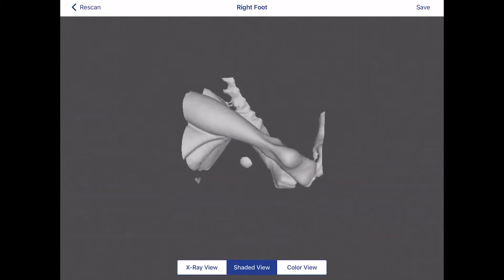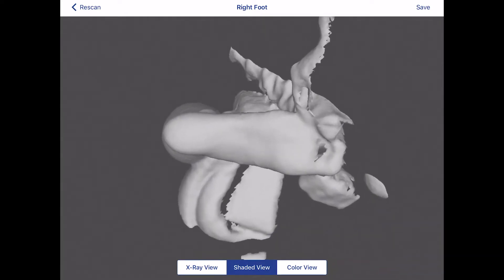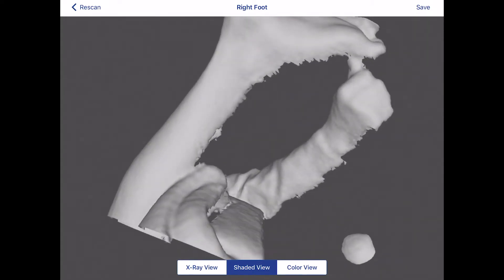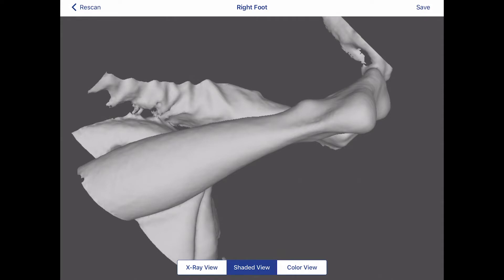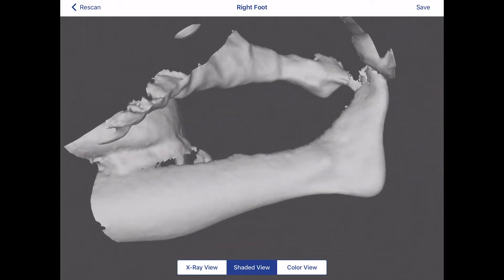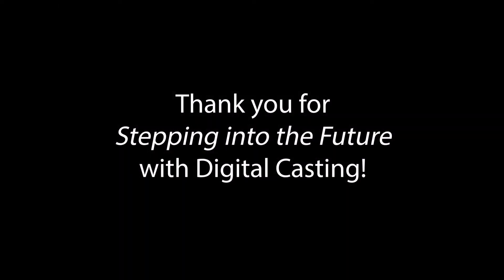Confirm all anatomy appears properly in the cast, including the plantar surface of the foot, the posterior aspect of the heel, the medial arch and malleoli, the posterior aspect of the lower leg up to the height of the brace you are prescribing, the lateral arch, and the distinct outline of the malleoli. Thank you for stepping into the future of digital casting.